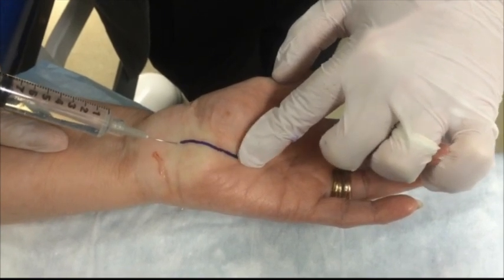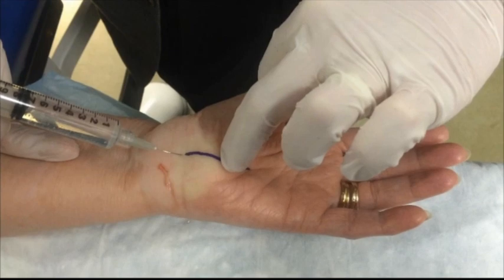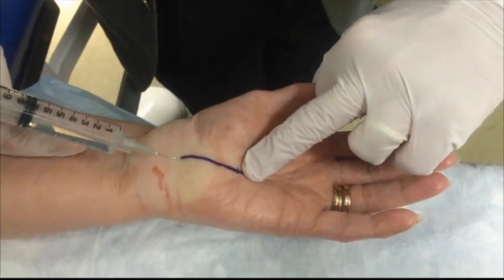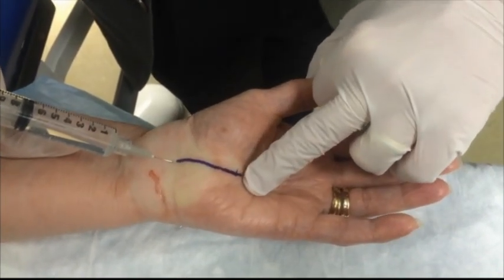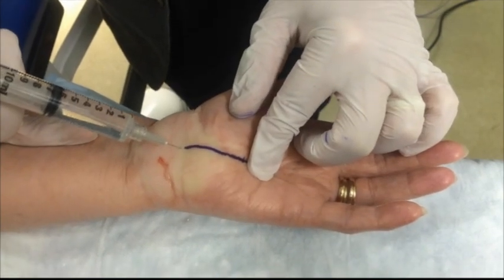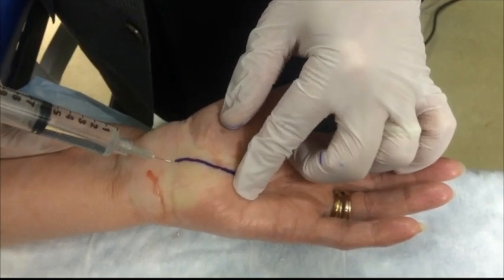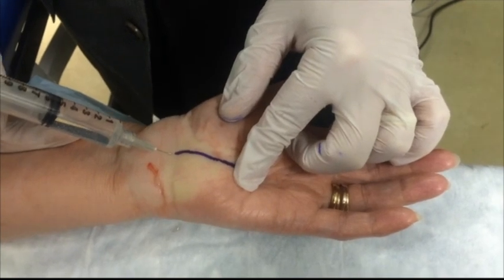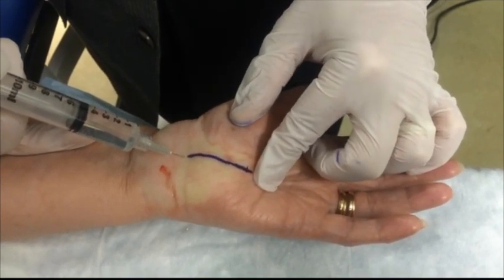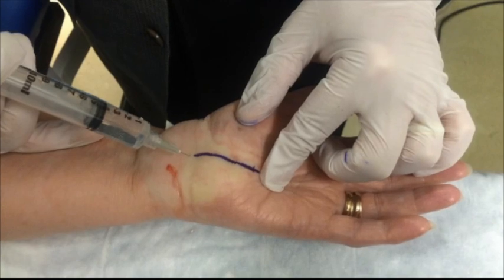Blow slow before you go. I always palpate to see where the local is — white here means functioning epinephrine, but non-white means local still not functioning, so I don't want my needle tip there. I'm trying to get a hole in one, meaning she just feels the first poke. If she feels pain two times, that's an eagle. Three times is a birdie. I score myself and my residents each time we inject local anesthesia for carpal tunnel — it gives instant feedback so we know we're getting better.